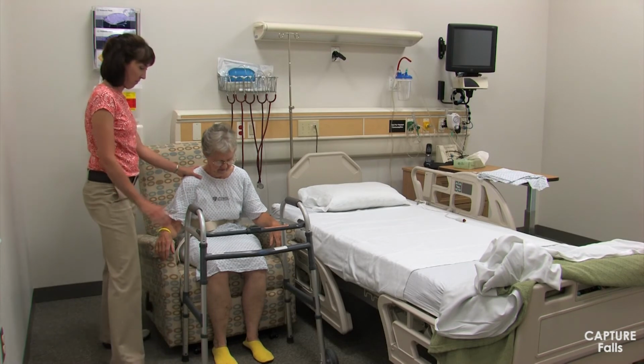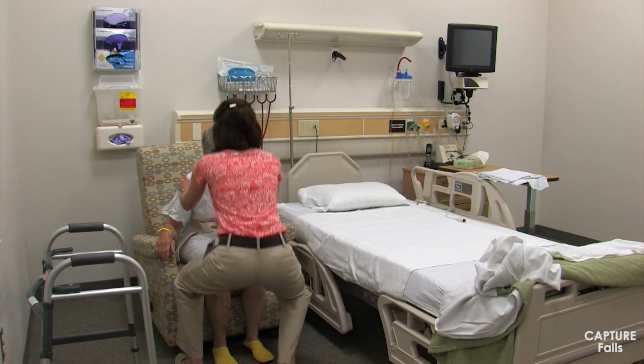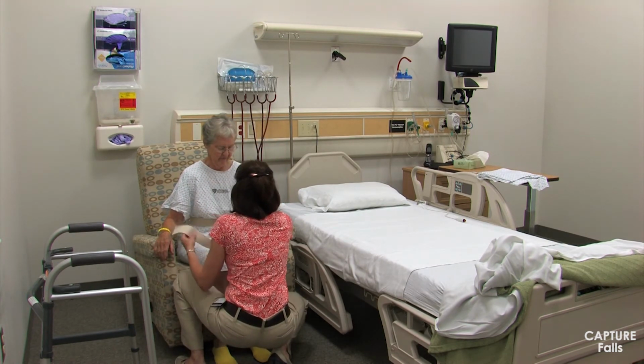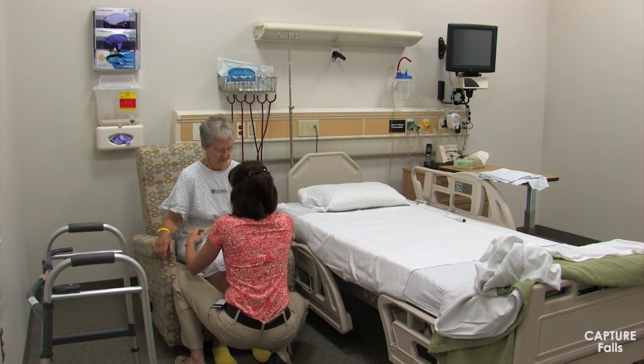Once the patient is sitting, move the walker out of the way. If needed, help the patient scoot back in the chair and remove the gait belt from her waist, or at least loosen it for comfort.